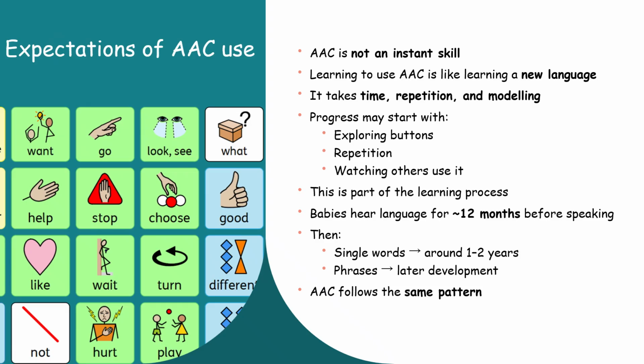Okay, so this slide is really about managing our expectations as communication partners. AAC is not an instant skill, and I really want us to recognise that. Learning to use the AAC system is very similar to learning a new language. If we think about school when we're learning Spanish or German, it takes us a long time. It takes time, repetition, exposure, and lots of modelling from the people around the child. So that's family, that's mum, that's dad, that's brother, that's auntie, uncle, that's staff, that's everyone around.